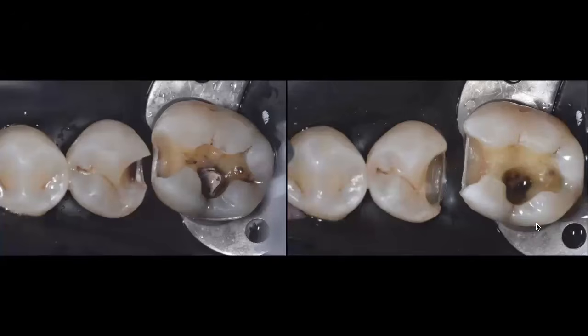All these margins are now beveled. They're nice and smooth, because that also has a lot to do with the ideal adaptation of the band in these proximal boxes. And not only the ideal adaptation of the band, but also the ideal adaptation of the composite to the band and to the beveled enamel.